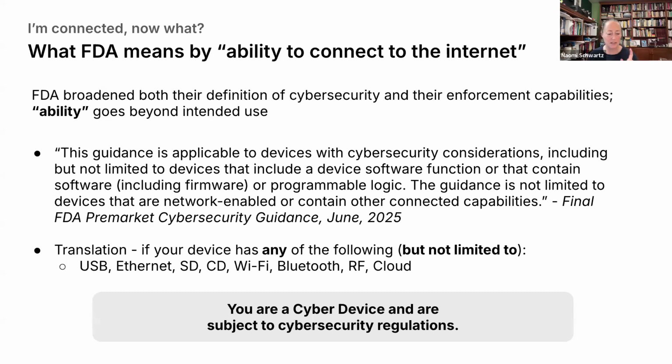Note that the entirety of the eSTAR section being filled in is not the same as having comprehensive data for every element of the eSTAR section. There are times when it is not necessary to provide extensive documentation based on risk and based on the connectivity modalities and things like that, but they do expect you to say something for every element. That something may be a blank document that says this section is unnecessary because, and please have a very strong rationale if you do that. But you can say this section is not relevant. Again, with a strong rationale.